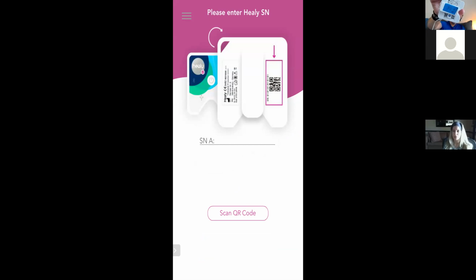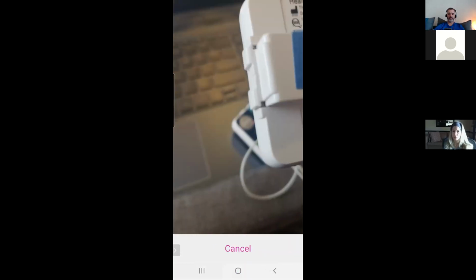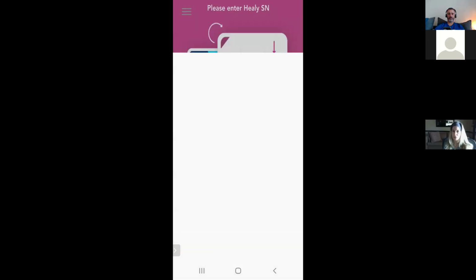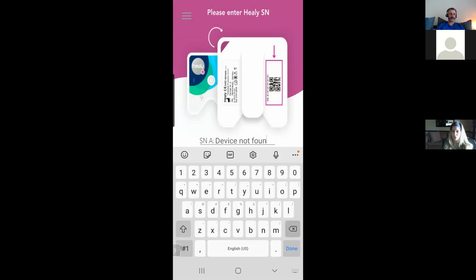And usually what I do is put my thumb over one of them, so I cover up one code and let the device scan just that one. So when I hit scan, boom, the serial number comes up right there. And see, sometimes you run into that issue: device not found. So I'll just do it again.